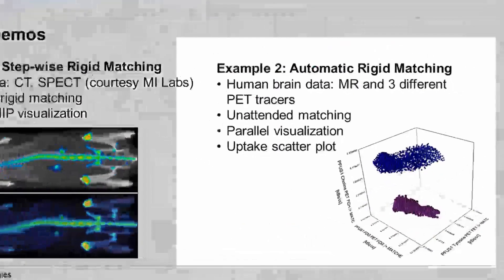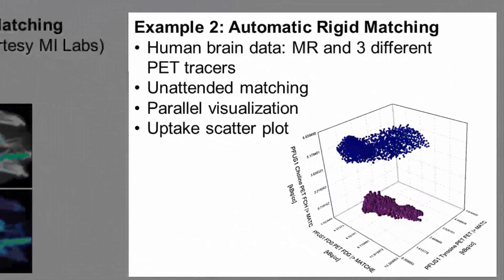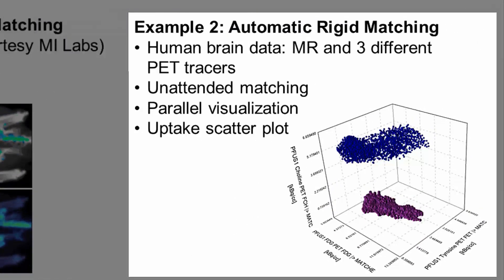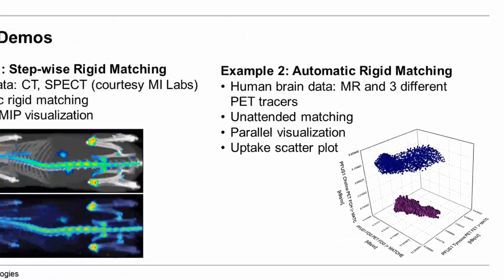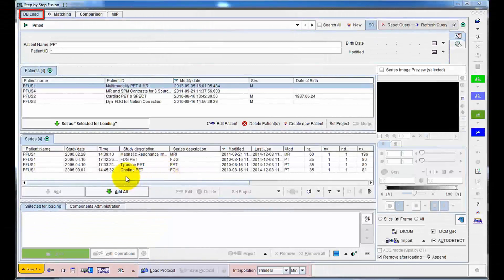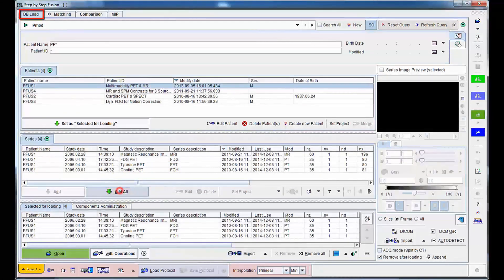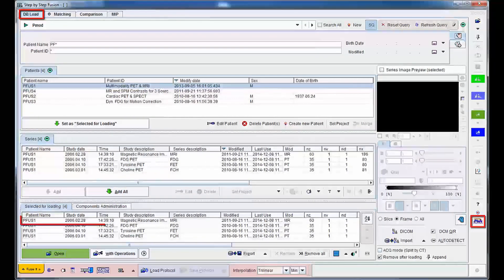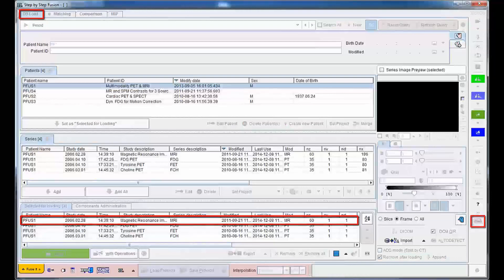In the second example, images acquired with three different PET tracers are registered to an anatomical MRI. In this brain tumor case, an unattended rigid matching workflow can be successfully applied. The four image series are selected in the database browser and the default processing pipeline is activated. As PMOD's default is to use the anatomical series as the reference and apply rigid cross-modality matching, no further interaction is needed.